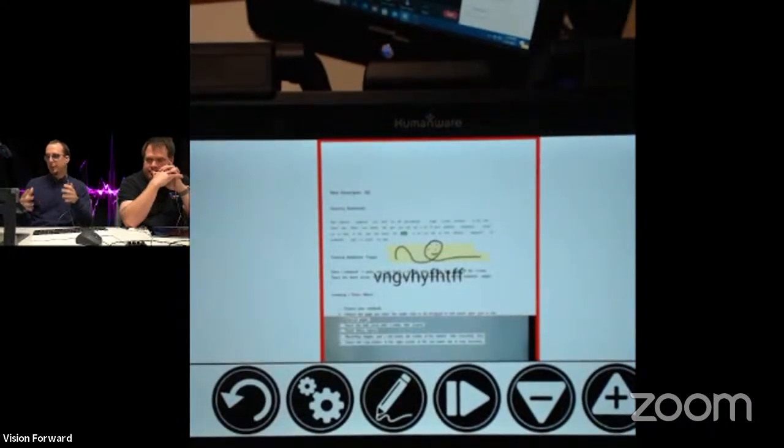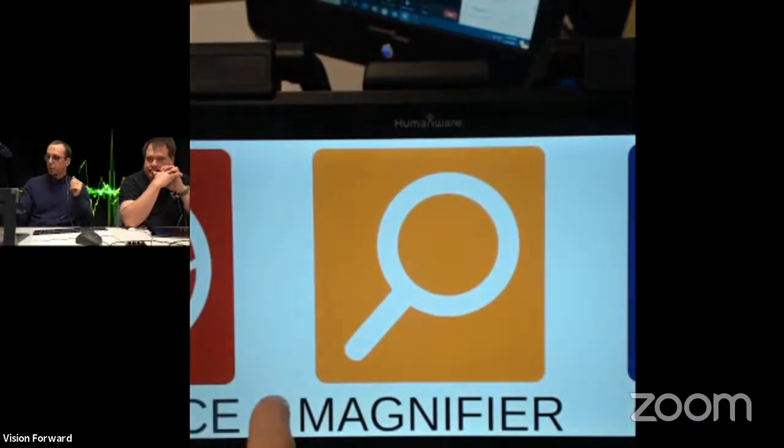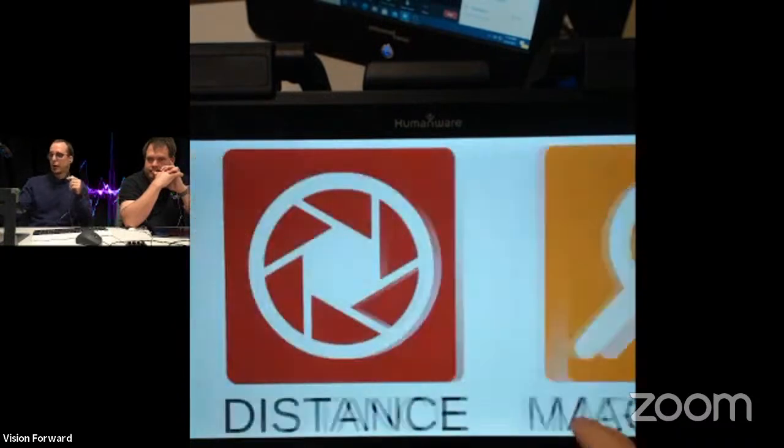Now, I'm not going to do a full demo of this because we have a fair few things to get through, but we do have a video covering all the aspects, not of the Connect 12 actually, but of the Reveal, which is essentially the same device. Almost identical. Most of the features. You can see those at youtube.com/infocustechnology.